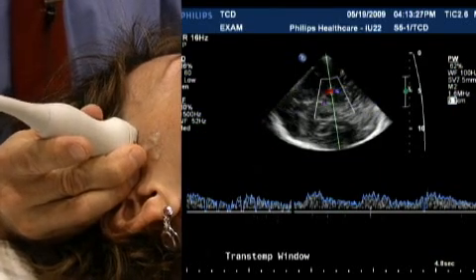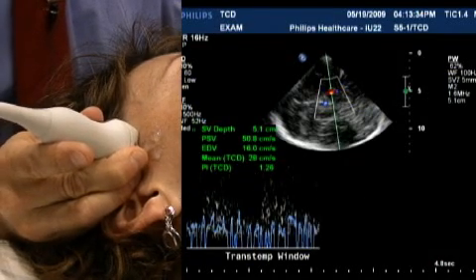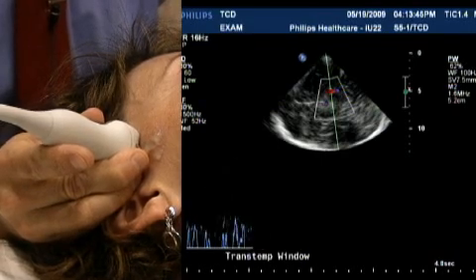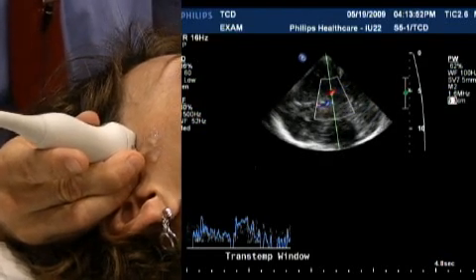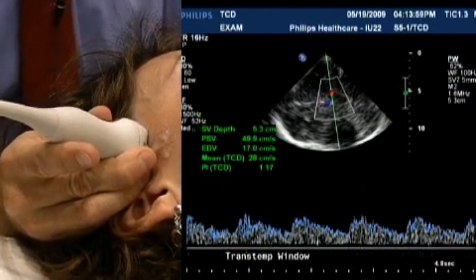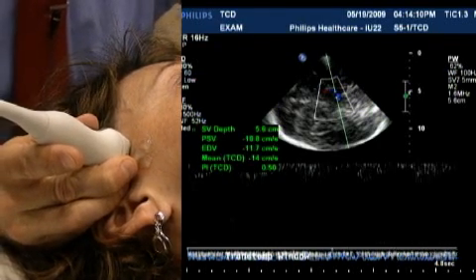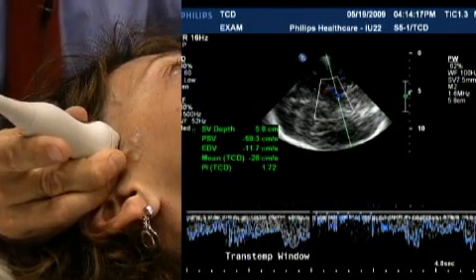both the P1 segment with flow coming towards us, and the P2 segment with flow going away from us. The P2 segment with flow going away from us.